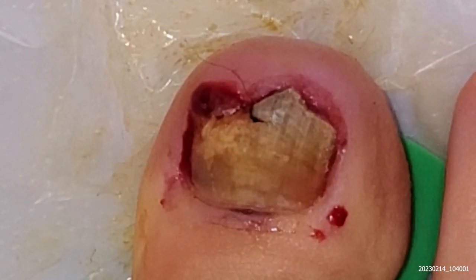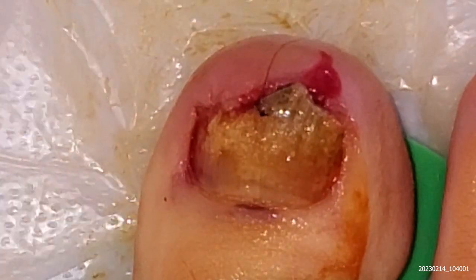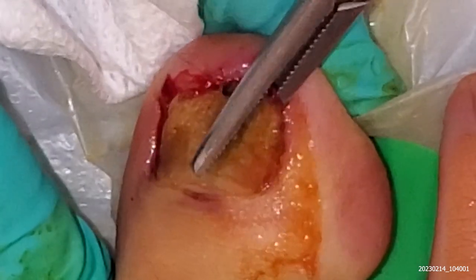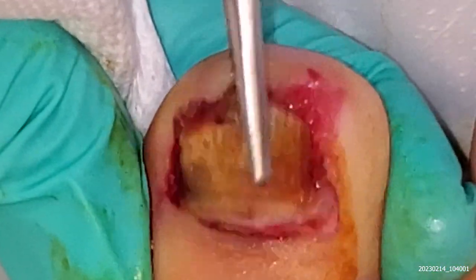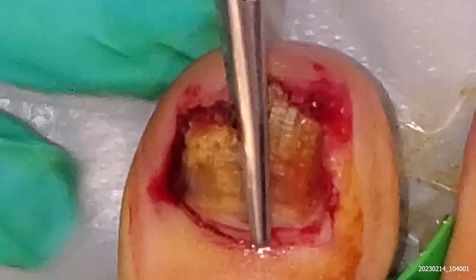I'm just going to get some forceps, and then I'm going to pull it and twist it. Oh, it's very deep. Twist it.